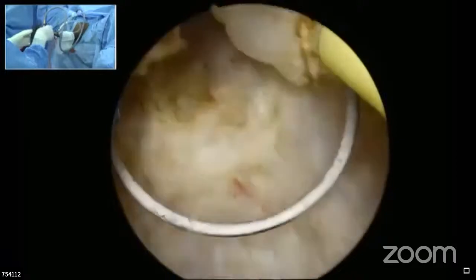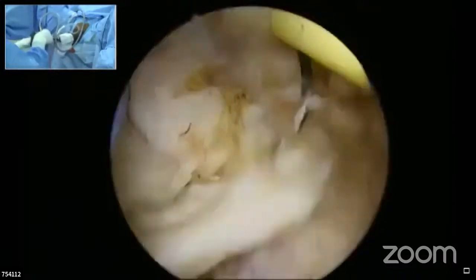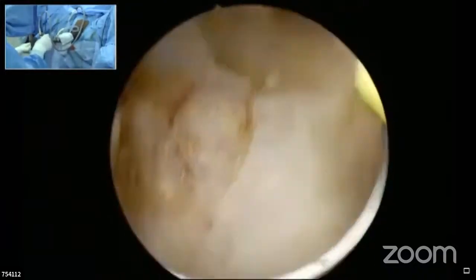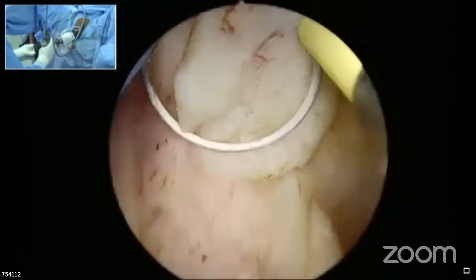Not much of significance with regards to clinical parameters such as the need for blood transfusion. But definitely, if someone is on dutasteride for a long time and then comes up for resection, the vascularity is significantly less. You would have a happy prostate, something similar to this, instead of a very juicy and vascular one.